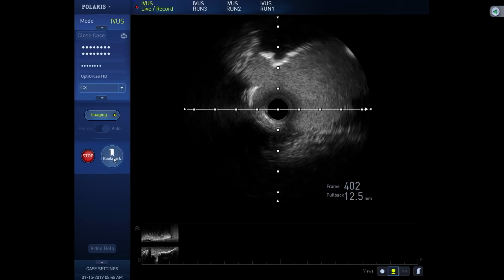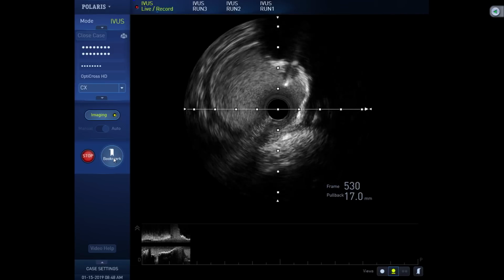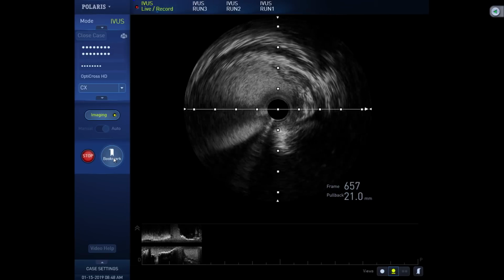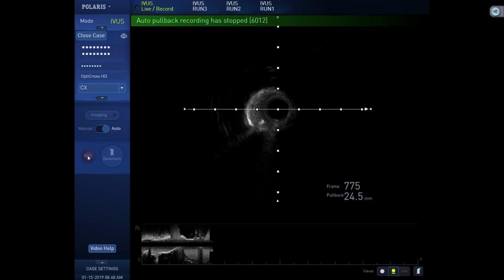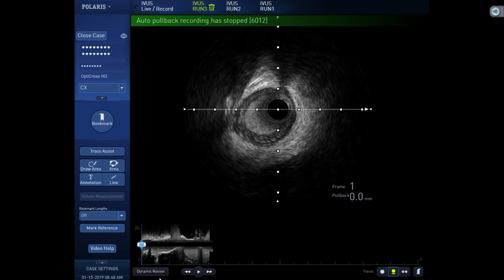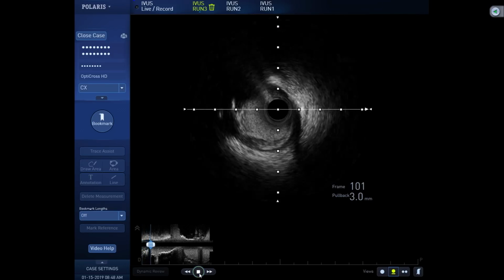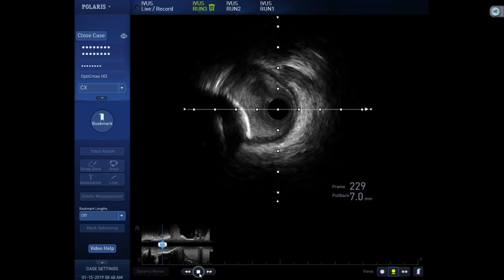Okay, this is the ostium. Okay, this is the aneurysm. So no disease, minimal to nothing. That is what we discussed. That provides the rationale: we have identified the aneurysm in the left main, at that angle of the LAD and left main, where the ramus should be coming; instead of the ramus, we have an aneurysm. That provides a complete rationale for a crossover single stent. Okay.